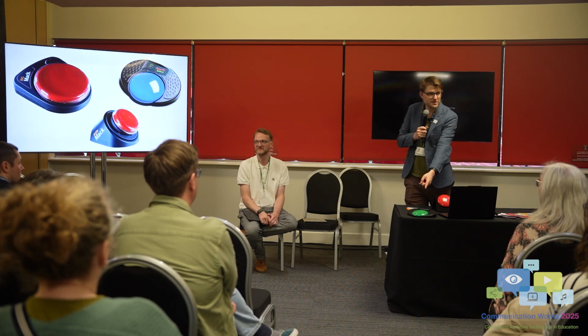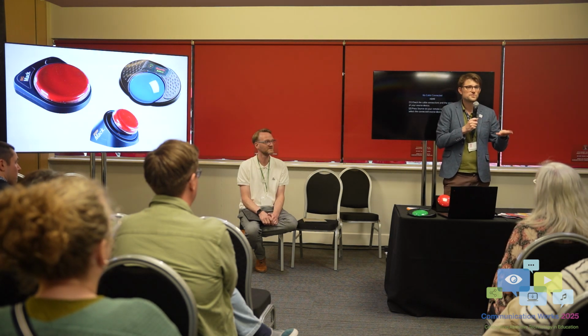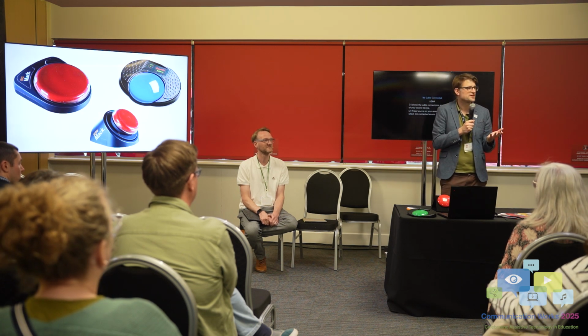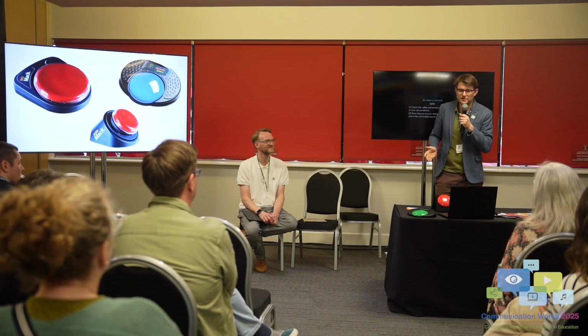All you need is one of these talking switches, which includes in some cases the ones that you can get for doggies, which they're beginning to use in schools, which I think you get like 6 for £15, so they're actually pretty good. I was a bit hesitant at first, but they're pretty good.